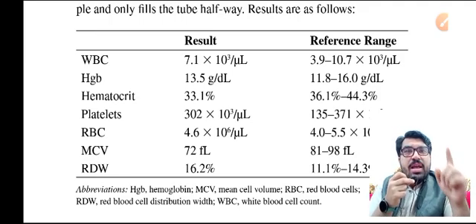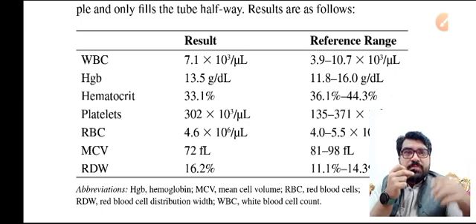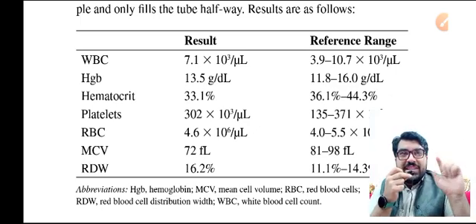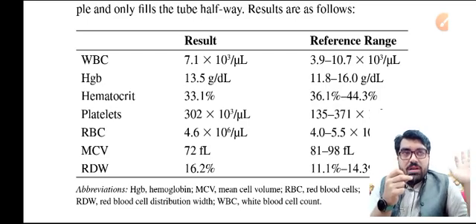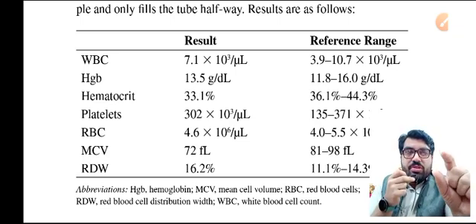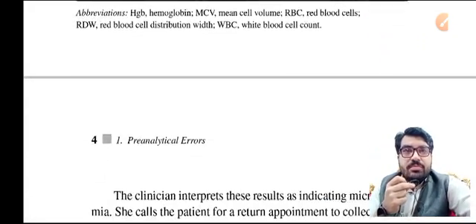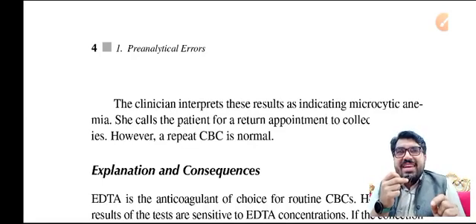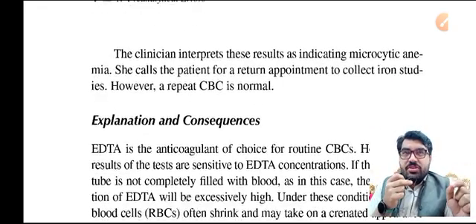If you look at the MCV, that is 72, and the hemoglobin is normal. This looks like microcytosis — but the patient is otherwise well, it is a routine examination. I will tell you why there is apparent microcytosis: this is an error, not an actual finding in the patient. The clinician interprets this as microcytic anemia, calls the patient for a return appointment, and orders iron studies.